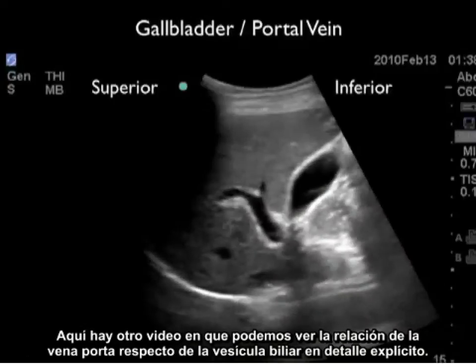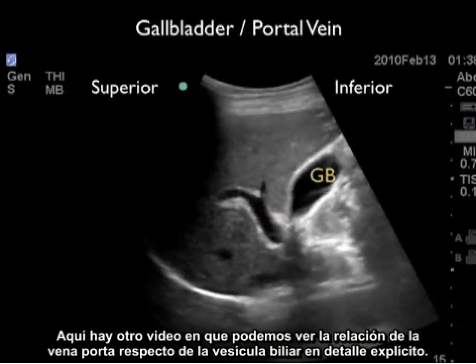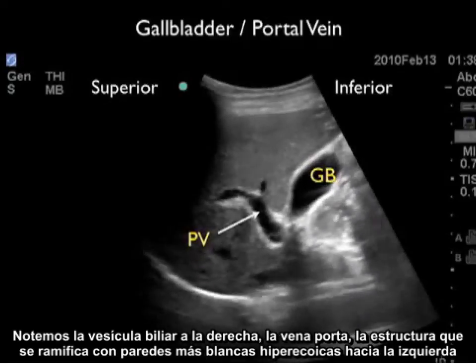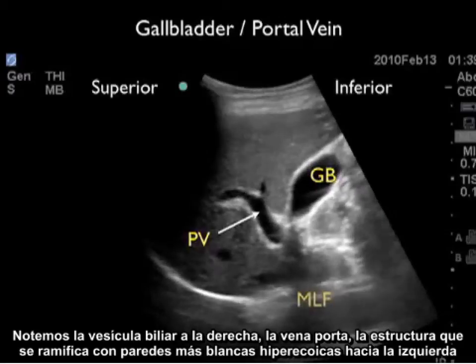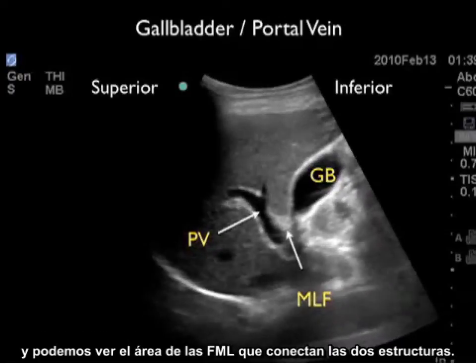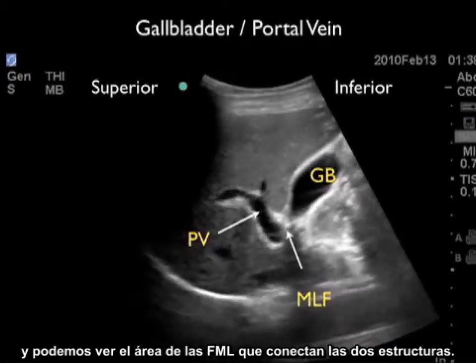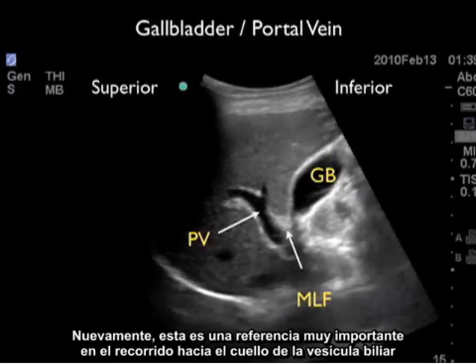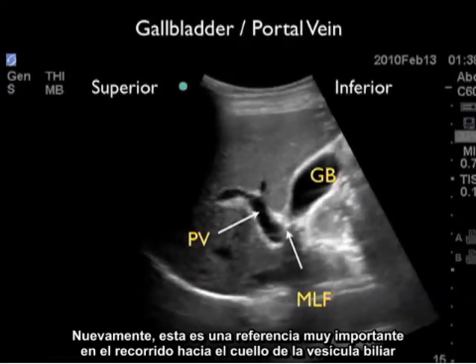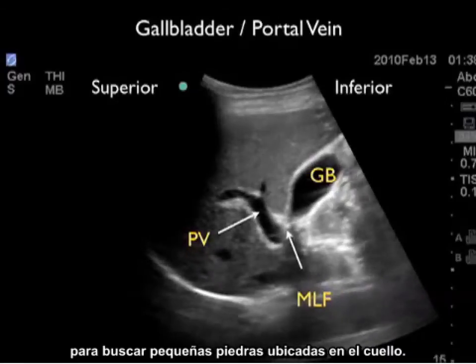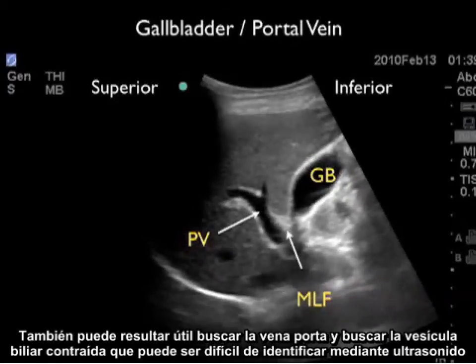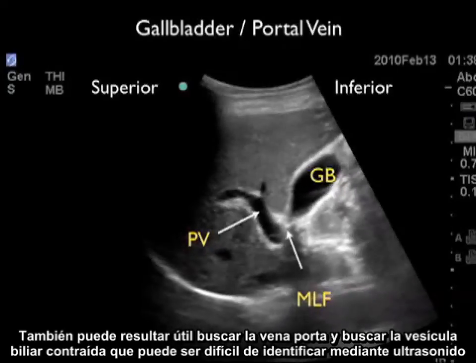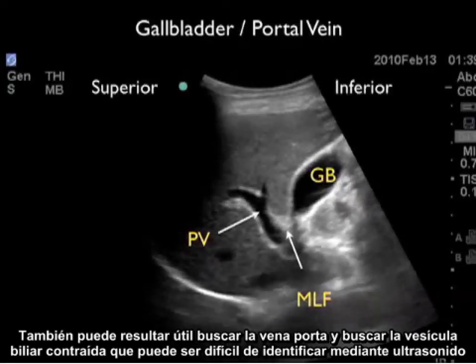Here's a video clip showing the relation of the portal vein to the gallbladder in explicit detail. Notice the gallbladder to the right and the portal vein — the branching structure with hyperechoic walls — towards the left, with the median lobar fissure connecting the two. This is a very important landmark for walking up to the neck of the gallbladder to look for small impacted stones. Looking for the portal vein can also help identify a contracted gallbladder that may be difficult to find on bedside sonography.